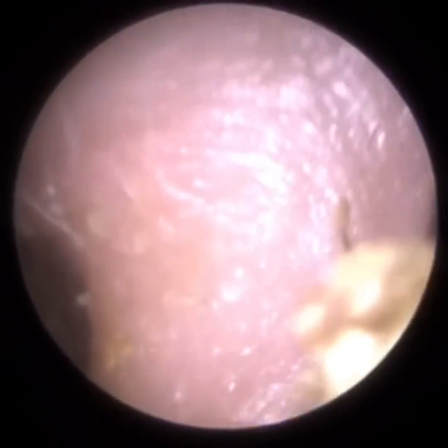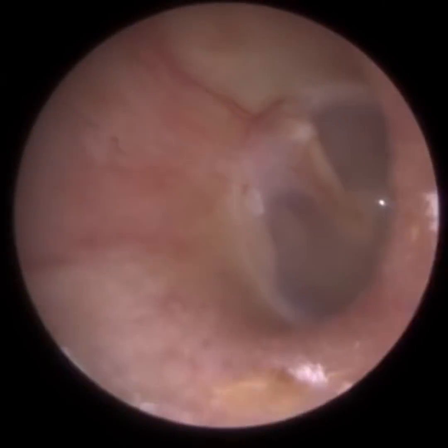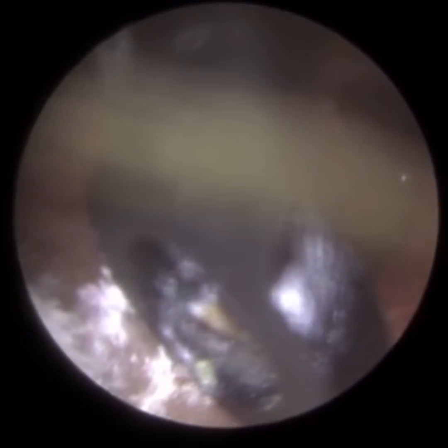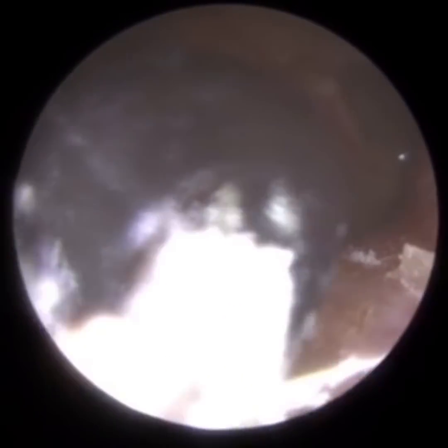So that's patient two, we're almost finished there. There is some lateral wax on the posterior canal wall. I did ask the patient if they'd been using cotton buds, because to me it looks like some cotton wool fibres are stuck to this.